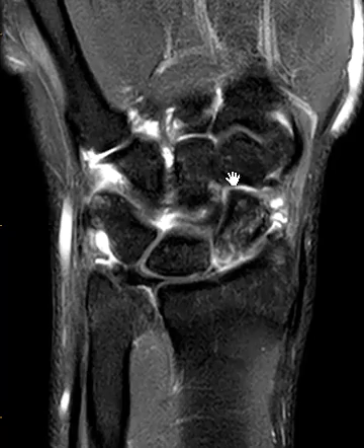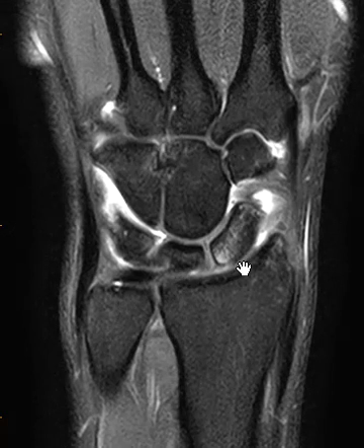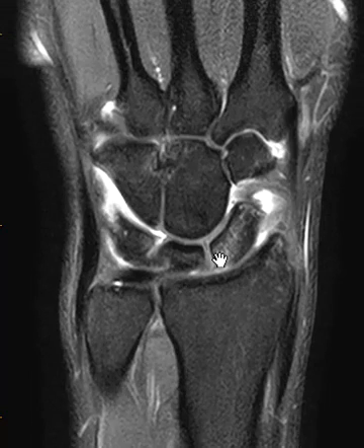Now we're going to go to a coronal PD fat sat. This is a view where we can see the scapholunate ligament a little bit better. Look at that marrow edema — this bright signal on the PD fat sat sequence is associated with the low signal on the T1 image. This is just a non-displaced fracture or periosteal avulsion type injury there, with no uplifting of the bone and patchy marrow edema underneath it.